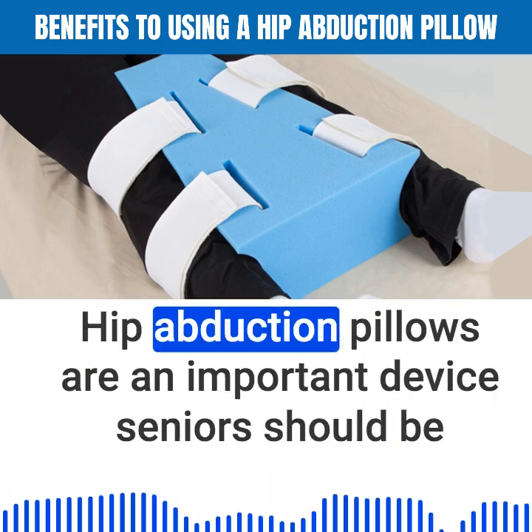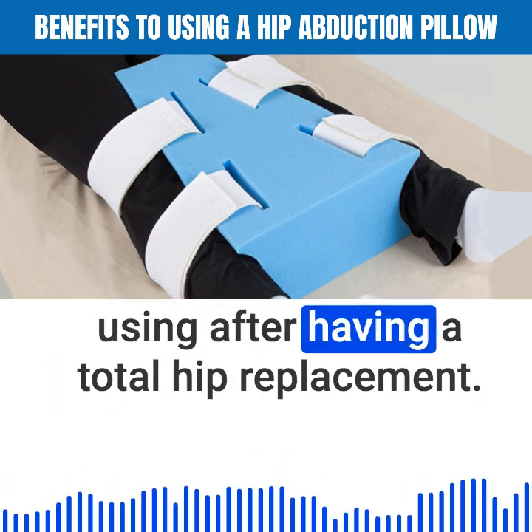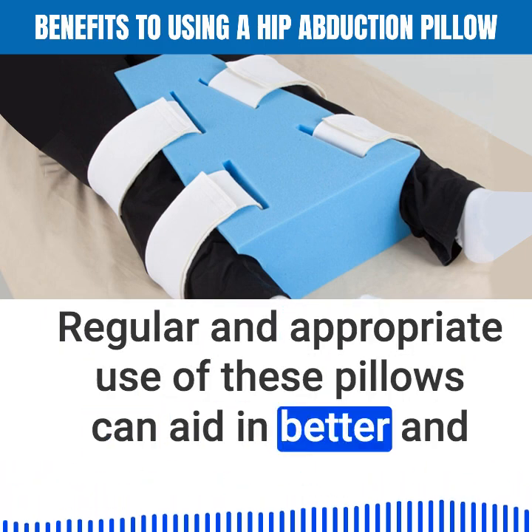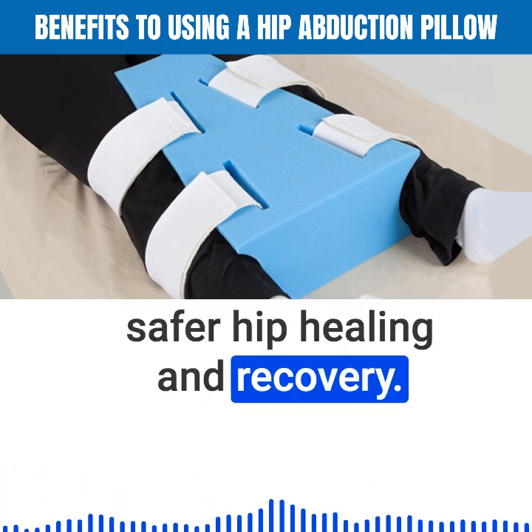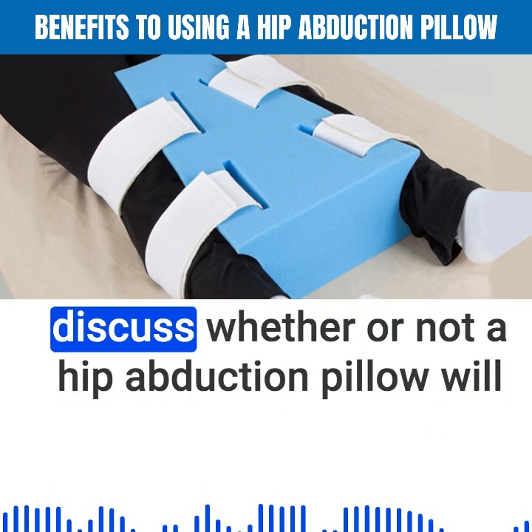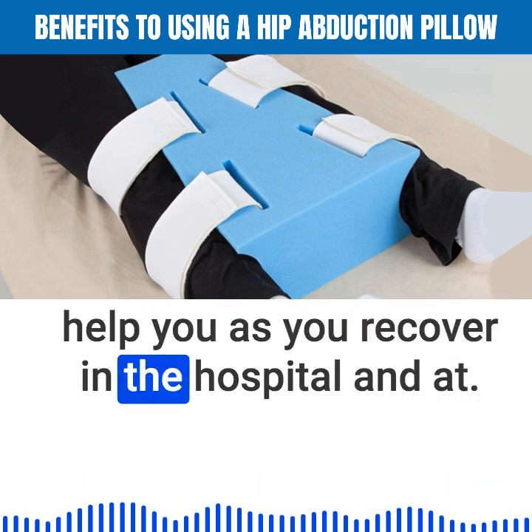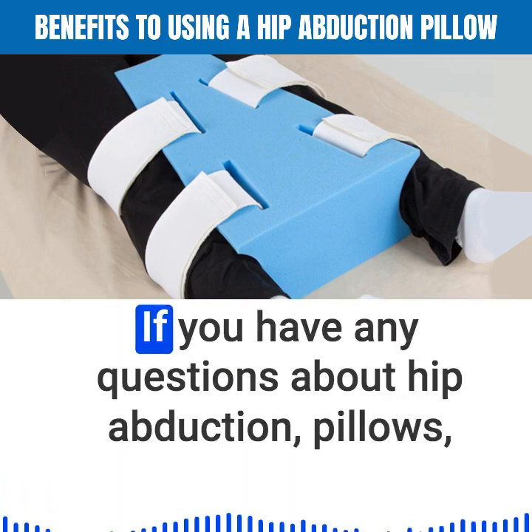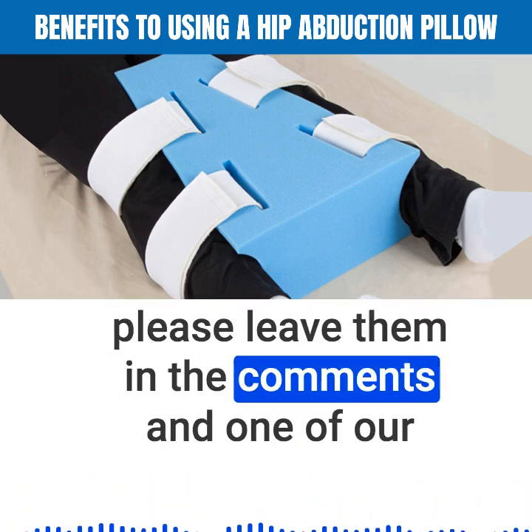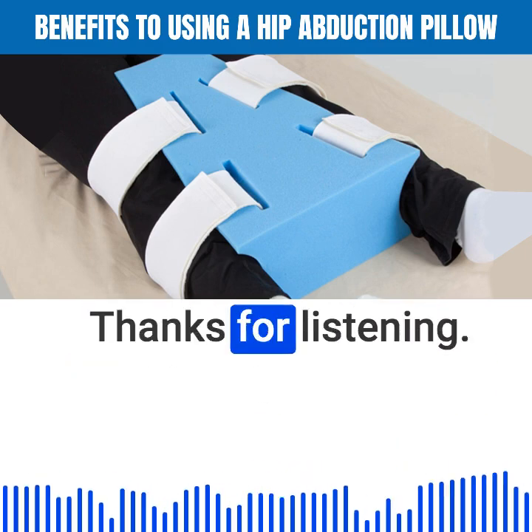Let's put it all together and summarize what we discussed today. Hip abduction pillows are an important device seniors should be using after having a total hip replacement. Regular and appropriate use of these pillows can aid in better and safer hip healing and recovery. Consult with your physician and orthopedic surgeon to discuss whether a hip abduction pillow will help you as you recover in the hospital and at home. If you have any questions about hip abduction pillows, please leave them in the comments and one of our rehabilitation experts will respond promptly. Thanks for listening.